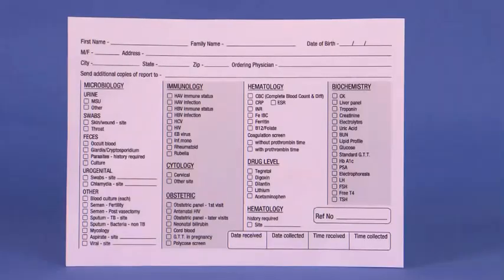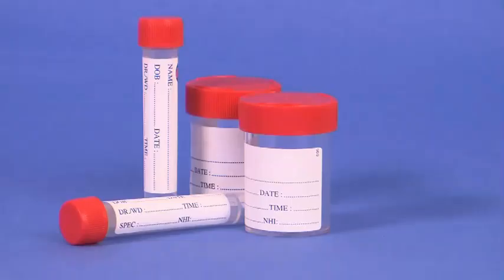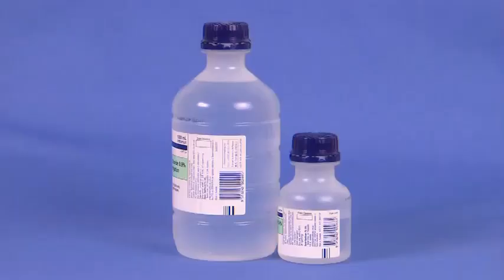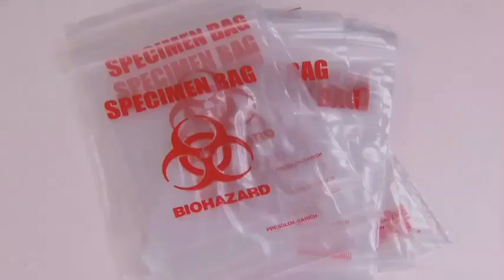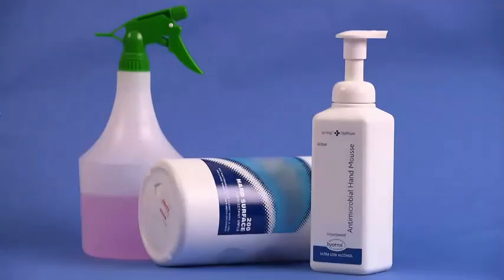a laboratory requisition form, tongue depressors, a sterile culture kit including sterile swabs with transport medium, a syringe, and a container for wound aspiration as needed, an examination light, sterile gauze squares, wound cleaning solution, dressing, a transport bag, gloves, biohazard bags. While these come in various colors, they can be identified by the universal biohazard symbol. Please check your institution and state regulations to confirm which bag is used. The patient's medical record and cleaning agents.